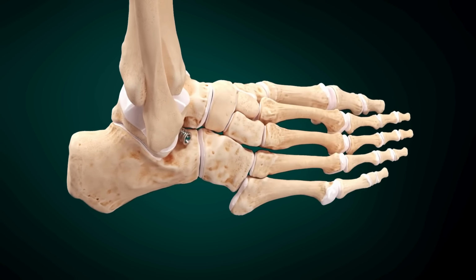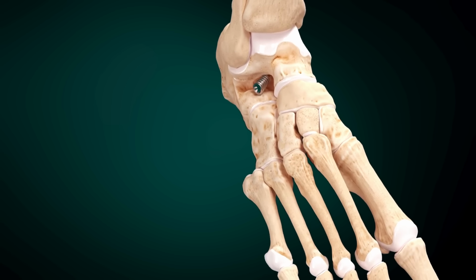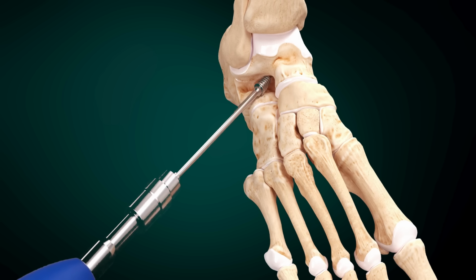If the Prostop subtalar arthroereisis implant needs to be removed, the instrumentation facilitates this procedure. After skin incision and blunt dissection, slide the blunt guide wire into the implant. The funnel-shaped opening helps to locate the cannulation in the implant. Use the driver to unscrew the implant.